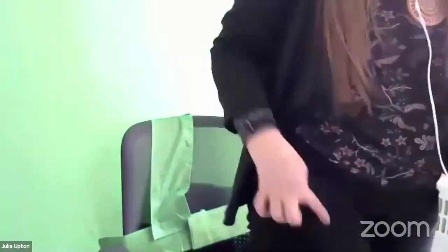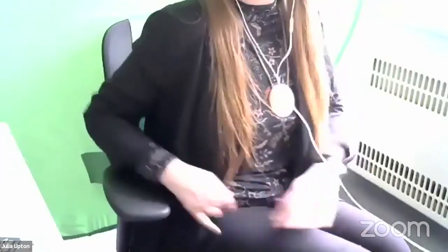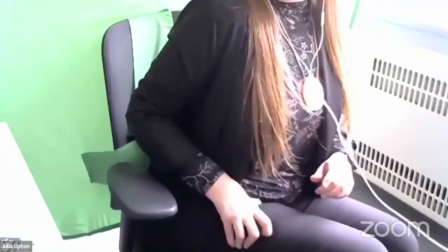It's not a minor point, because it is important to know where that location is in different views. So again, when I'm sitting, there's the seam of the pant, it's the upper outer part of the leg. And again, why is that so relevant, Dr. Upton? So, we're going for an intramuscular injection. So we're going for the big muscle at the front. Got it. Okay.